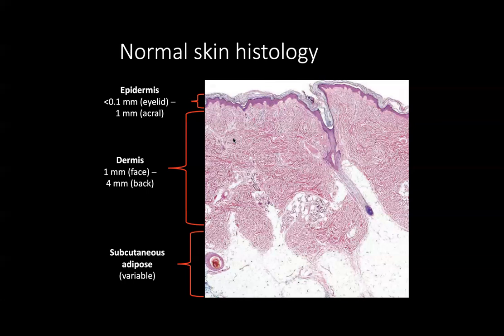In the dermis, you can have deposition of numerous types of inflammation. You can have cutaneous lymphomas developing here. You can have histiocytic processes such as granulomatous inflammation, granuloma annulare, for example. You can have deposition of materials such as mucin and mucinosis, or amyloid and amyloidosis. So the dermis is a source of a lot of dermpath as well. And many epidermal neoplasms can extend down into the dermis and even reach the subcute.